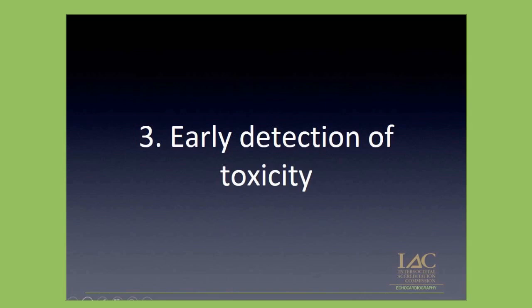Therefore, the message is, if at all possible, I use 3D echocardiography. But I know what some of you are thinking: that technology is not available in my lab, is that going to be the end of the world? Well, we obviously recommend that you use the best possible technology available in your laboratory for the accurate calculation of ejection fraction.